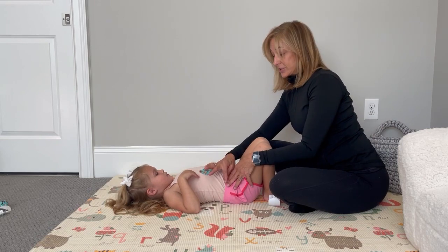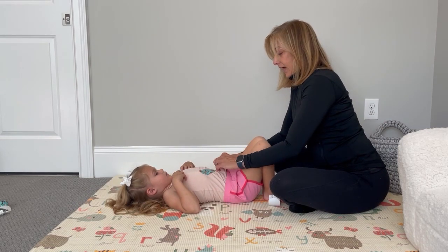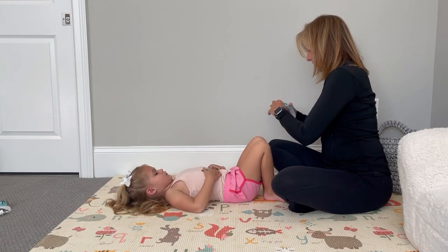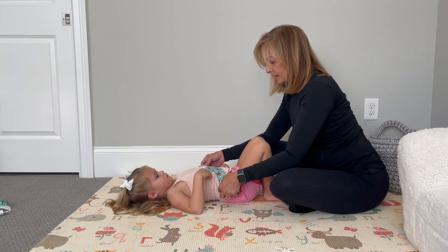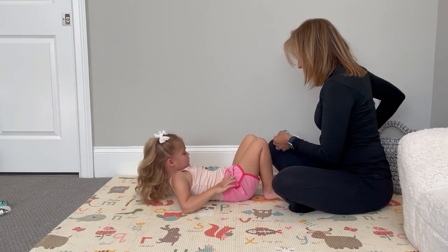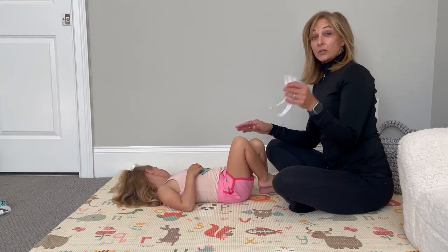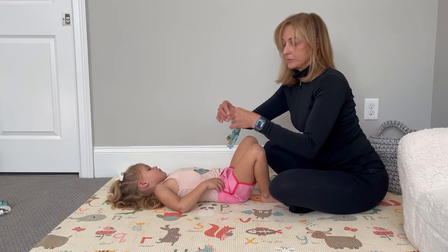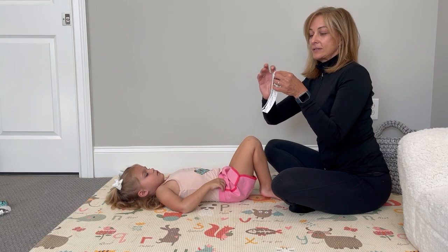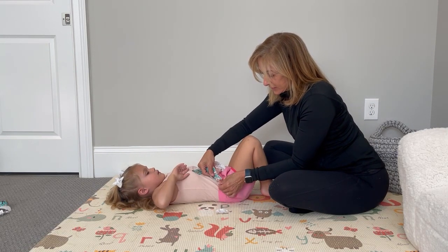You would put the second strip over here if you did two I-strips. Now I'd like to show you how to do a Y-strip on the stomach. You would measure across — I'm going to make this one a little bit longer — and then cut it. Remember to rip your tail so the whole tail is free; it makes it a lot easier. You're going to anchor at the ASIS just like you did before.